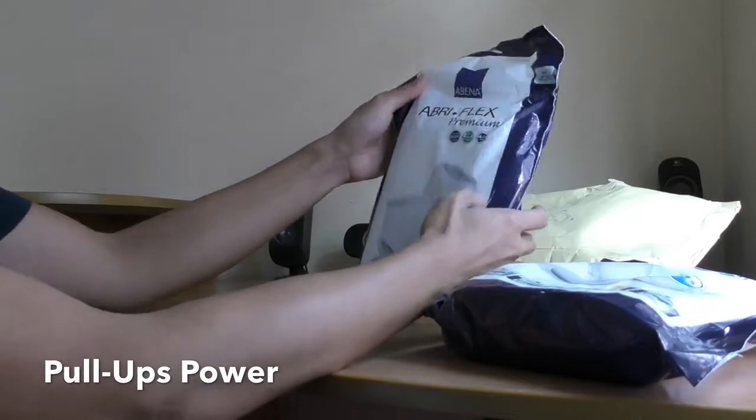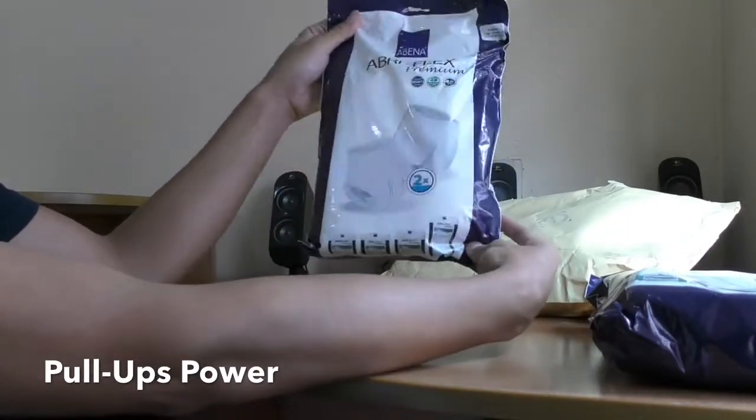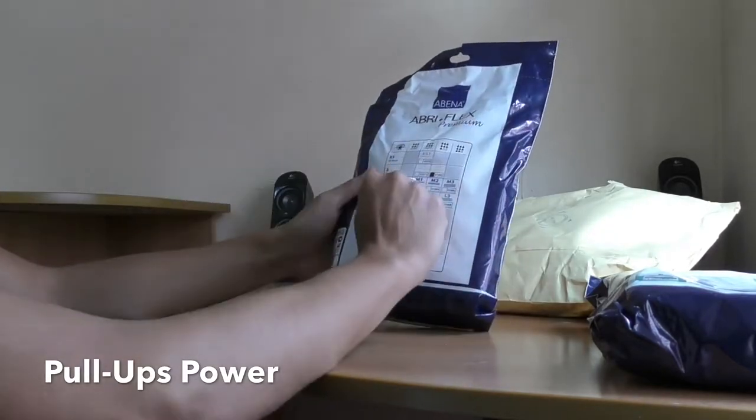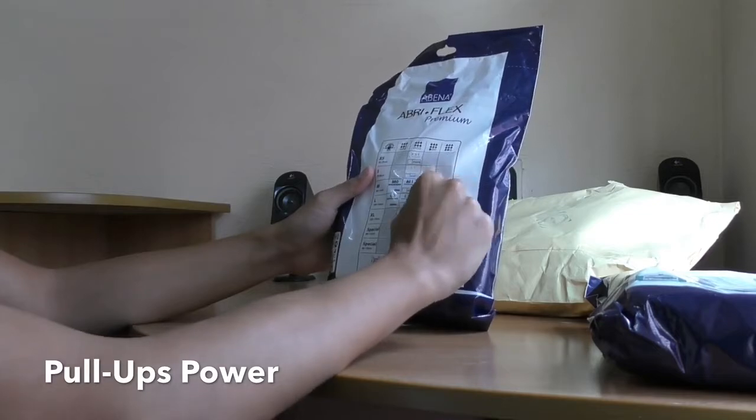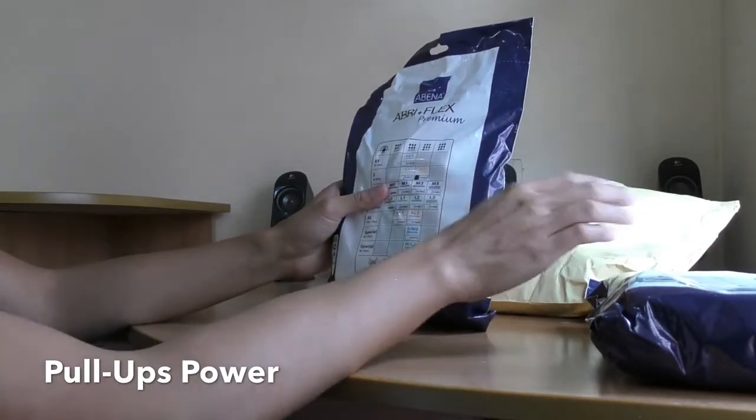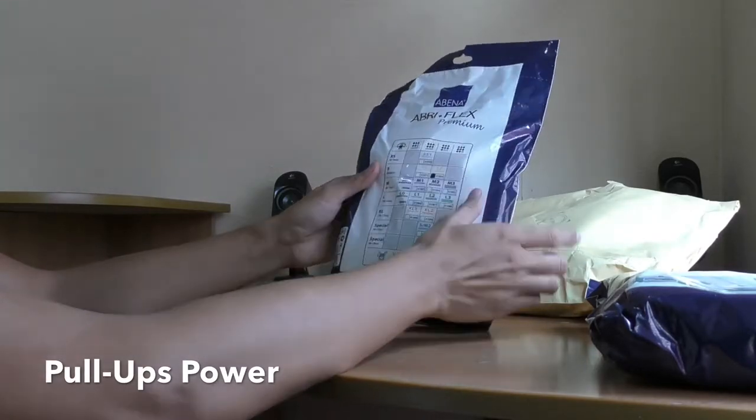This is a pull-up. This is AbriFlex Premium, small, same absorbency. And then a striper. This is for 60 to 90 cm.